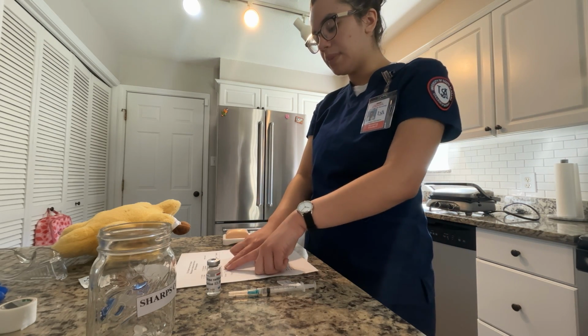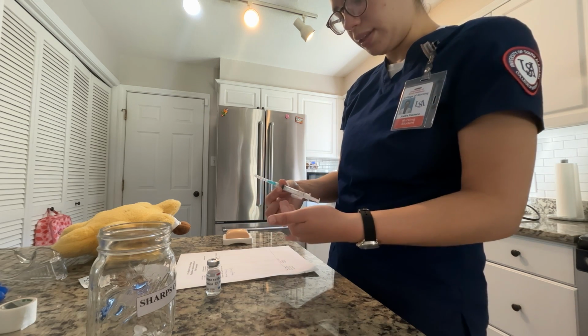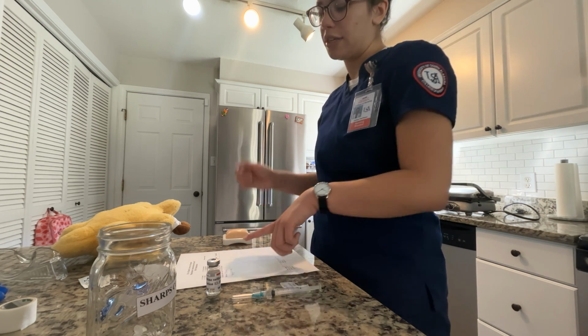He is to receive this medication intramuscularly. So for an intramuscular injection, I have a 3 milliliter Luer-Lok syringe, and then I also have a 23 by 1 inch precision needle, which are both good for IM injections.